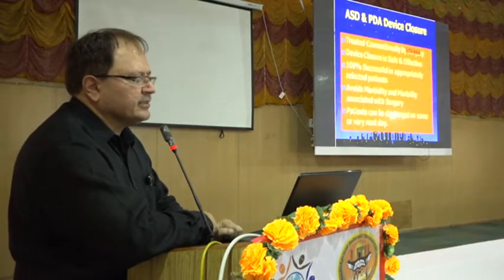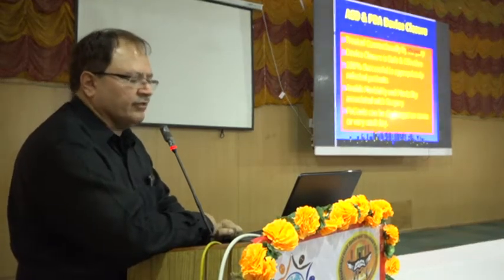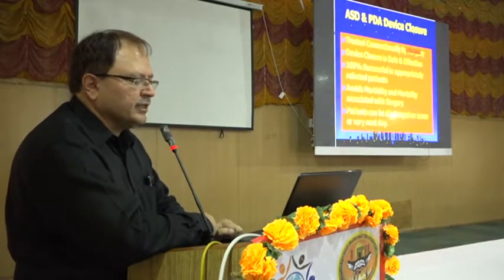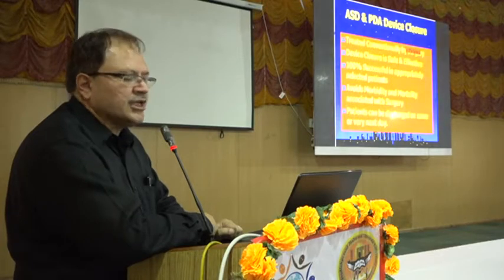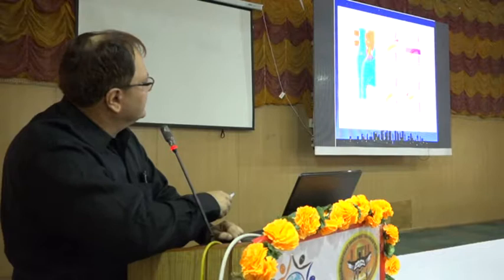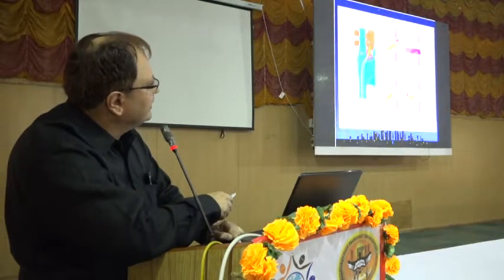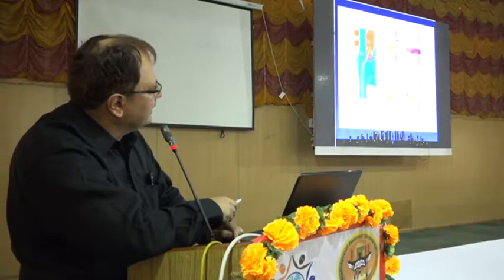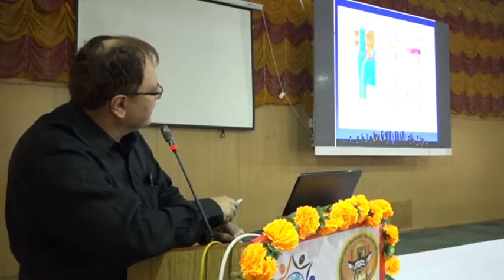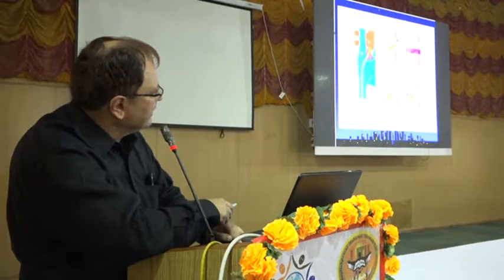It was treated conventionally by surgery. Device closure is safe and effective, 100% successful in appropriately selected patients. It avoids morbidity and mortality, and the patient can be discharged on the same day or the very next day. So what we do, like this is an atrial septal defect, so we do an ASD device closure. One disc is left in the LA and the second disc is left in the RA, and then the device is released.